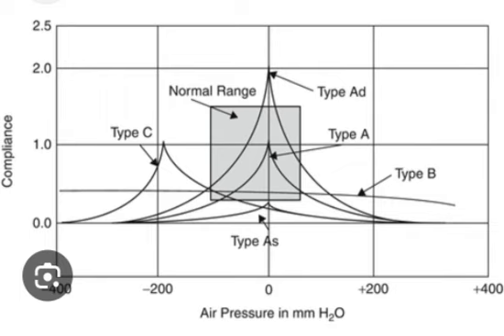Type C tympanograms are consistent with negative pressure in the middle ear space resulting from compromised Eustachian tube function and a retracted tympanic membrane. The categorizing of tympanometric data should not be used as a diagnostic indicator. It is merely a description of shape.